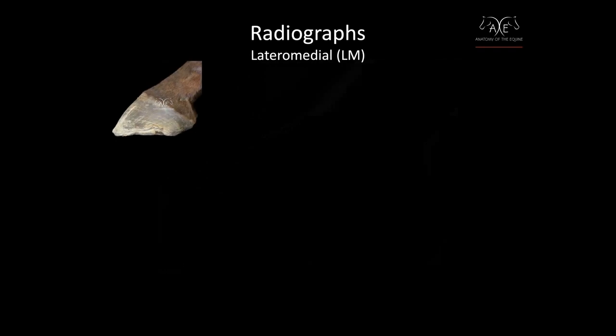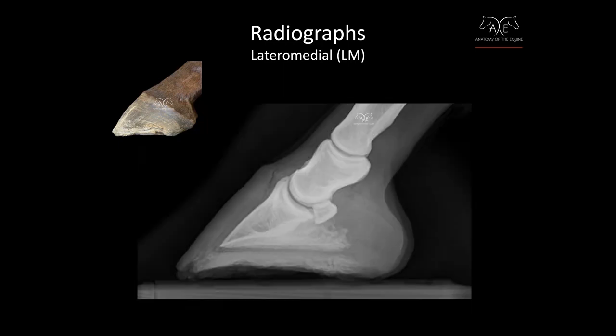This is commonly referred to as a lateral X-ray, but technically it is a lateral-medial X-ray, meaning the radiographic beam is shot from the lateral side of the hoof towards the medial side of the hoof. There's your coffin bone, here's your short pastern, and the navicular bone.